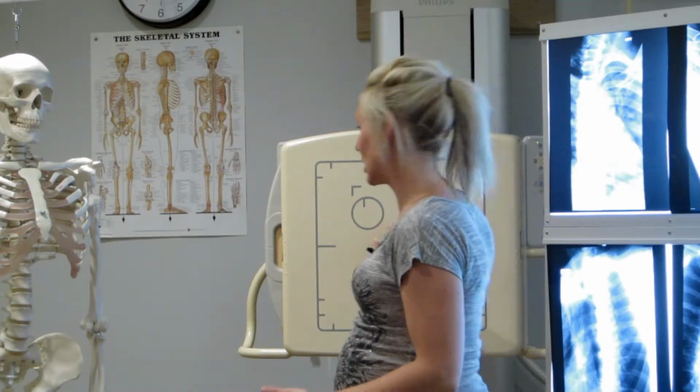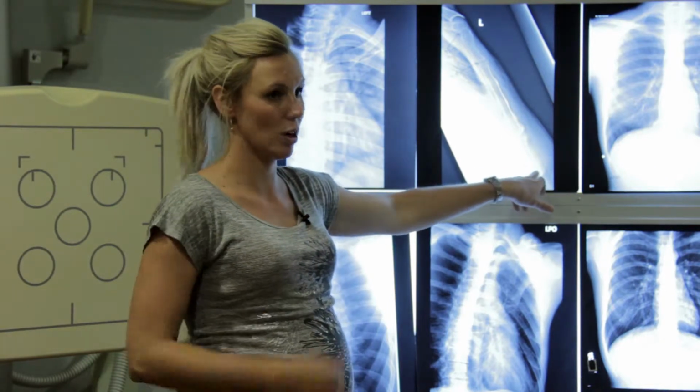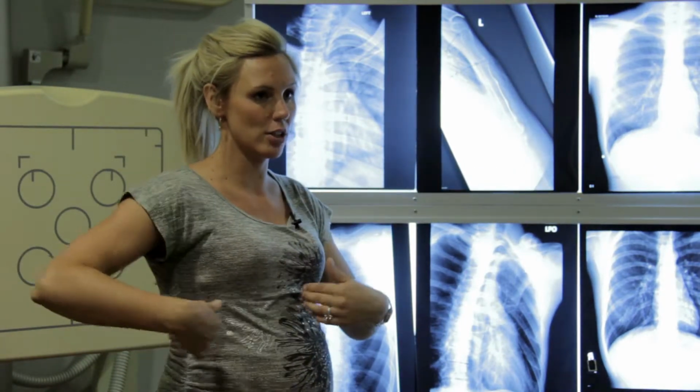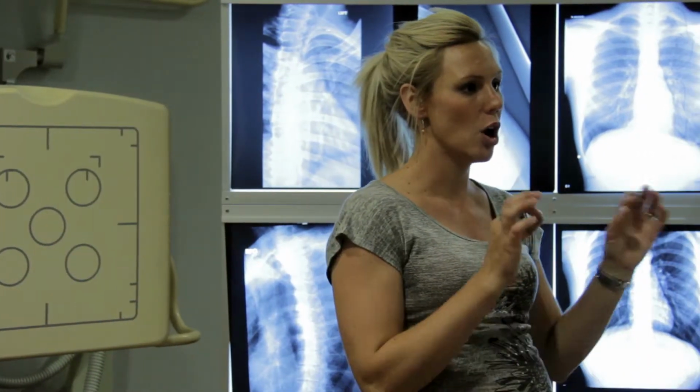But it's the same 3 pictures. The same thing that you just did here, you will do laying on the table. We're going to be centered slightly lower. Okay? If we have to see ribs 8 through 12, you center at about that kind of 9-10 region. We know how to find that now. So center at about the level of 9-10 to the site of interest. You do the supine, you do an RPO, and you do an LPO, all centered to the site of interest.